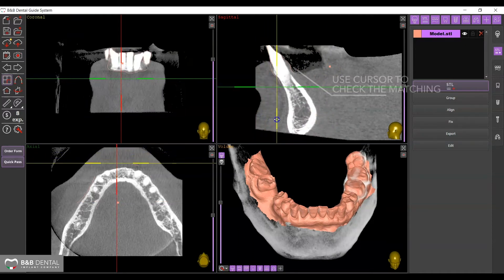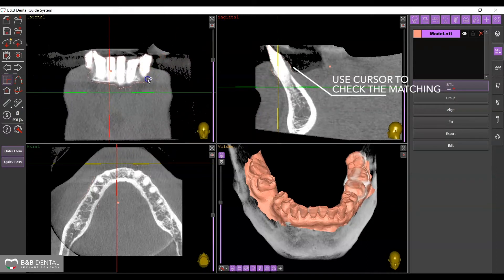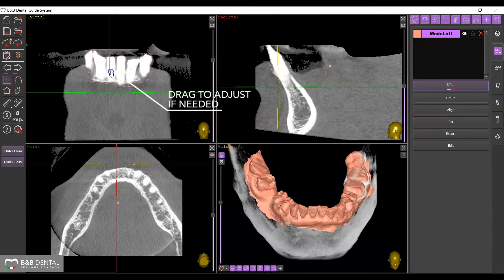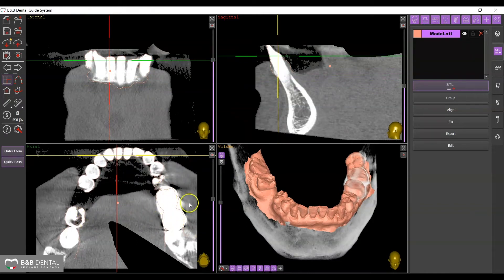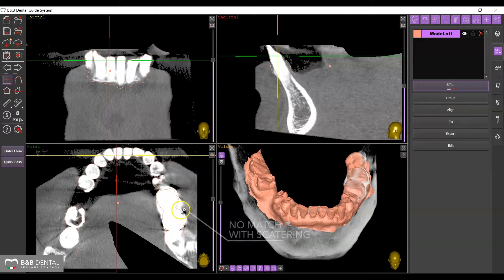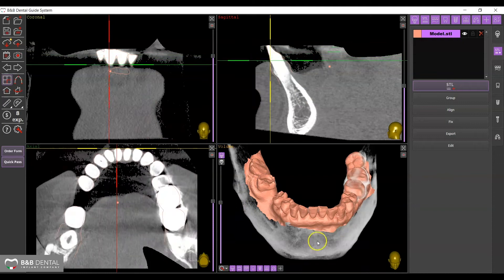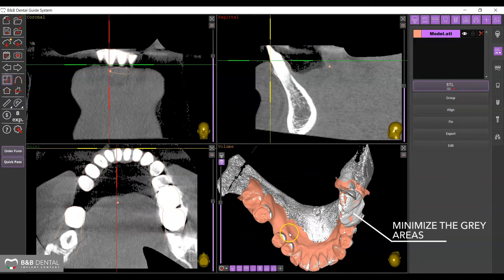You can check the precision of the matching on the home screen by using the cursors to move and verify that the STL file corresponds to the profile of the DICOM. If necessary, move or rotate the STL file to improve its positioning and minimize the gray areas to obtain a good matching.